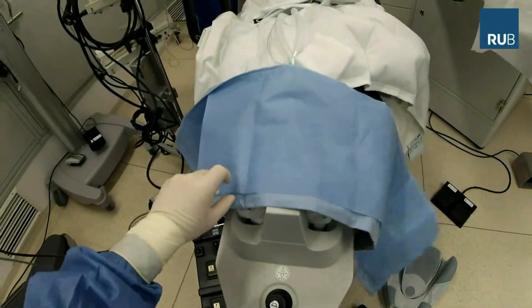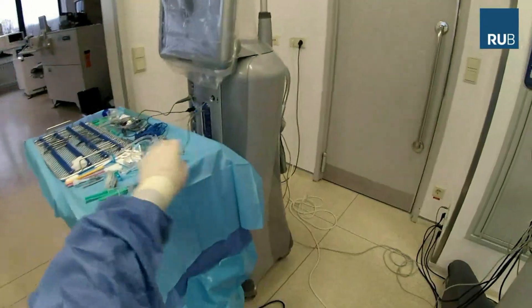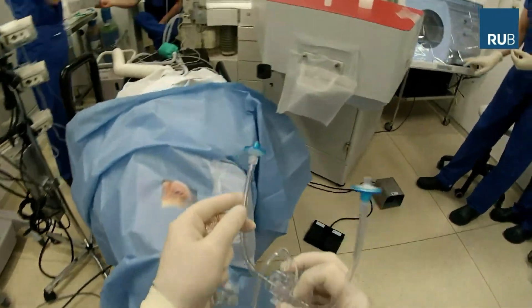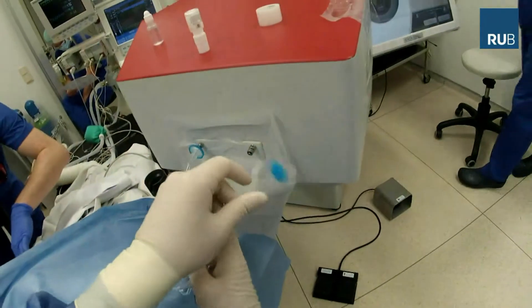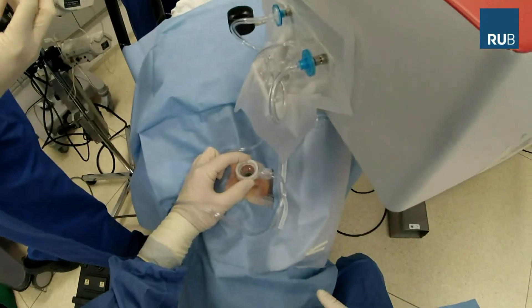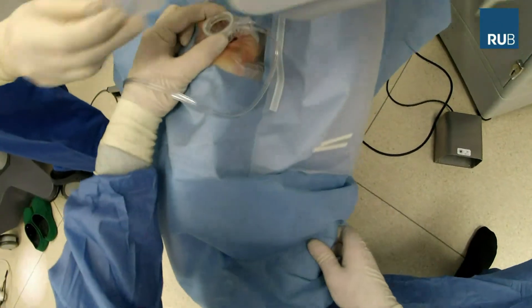The laser is installed in the operating room and you can see the anesthesia team in the back. After sterile draping of the eye, the suction ring of the liquid optics interface is docked to the sclera and filled with BSS. The patient on the bed is swivelled to the right under the laser and the suction ring is locked to the laser optic.